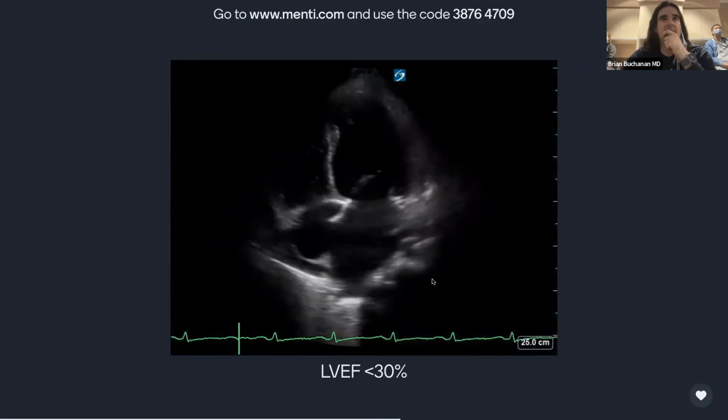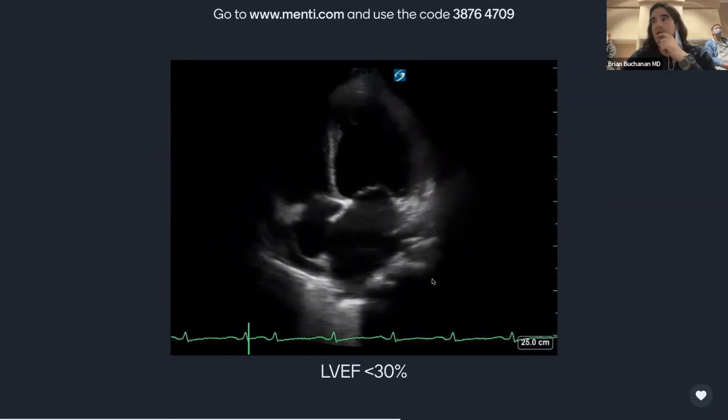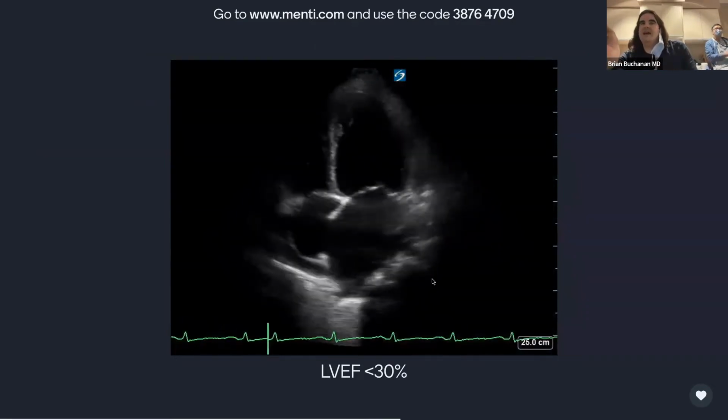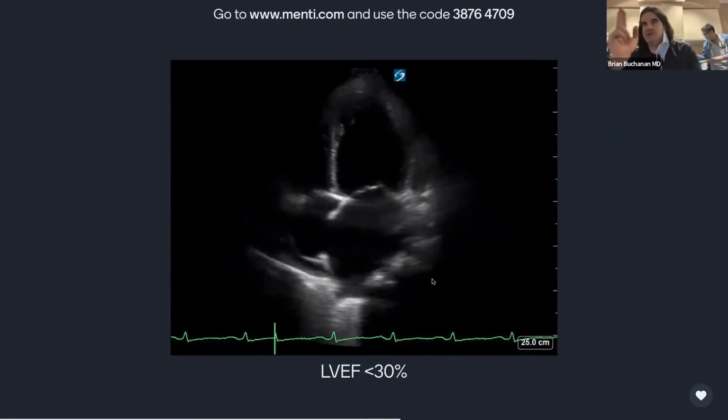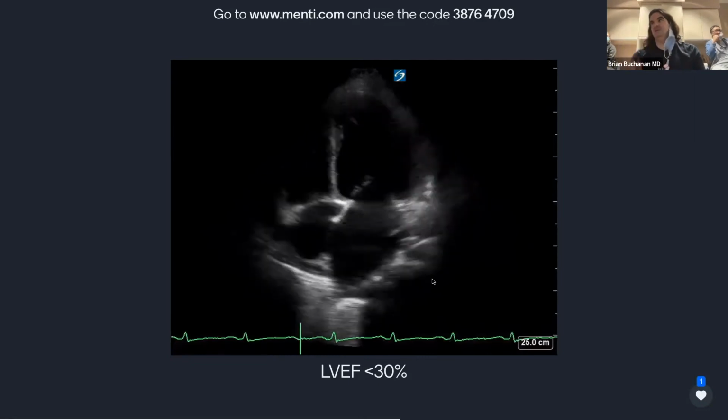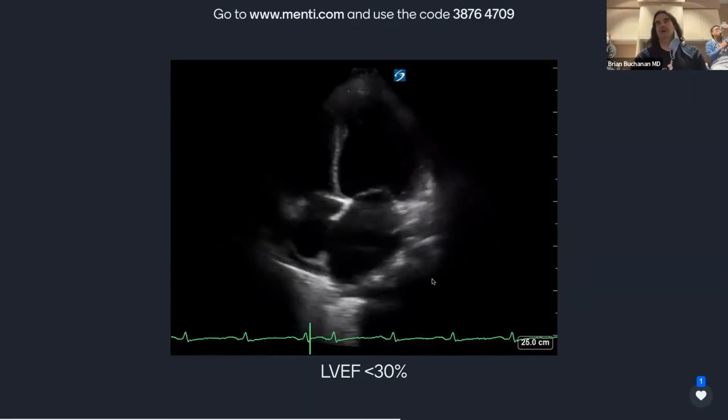Yeah, it's not moving at all, right? The endocardial excursion is when the wall moves inwards. The wall moves inwards slightly, but it's not thickening at all. In fact, it might be even a little bit thinned, which makes it more challenging to assess.